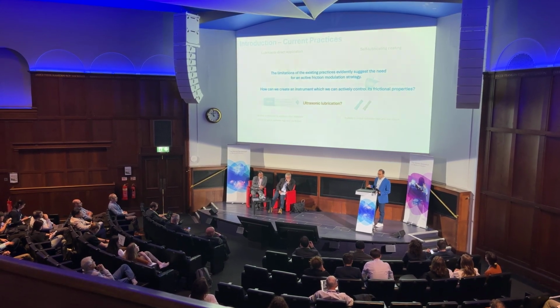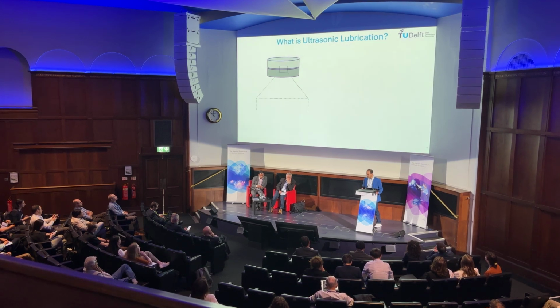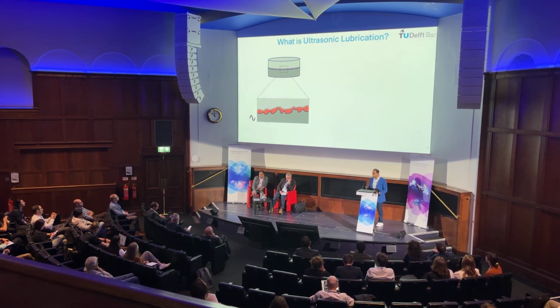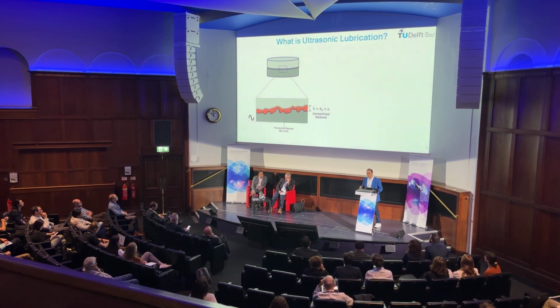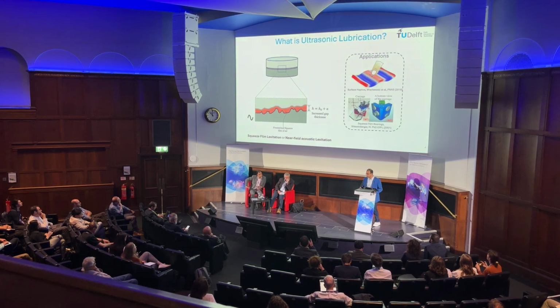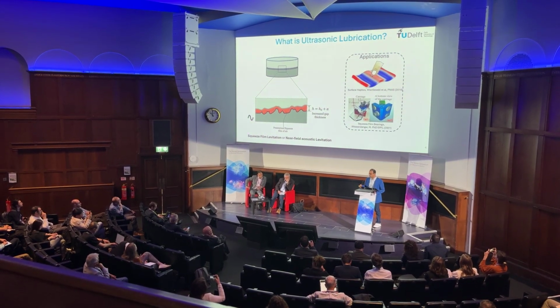One technology that can potentially answer this question is ultrasonic lubrication. But let's take a step back. What is actually ultrasonic lubrication? When you have two objects in close contact with each other and we start vibrating one of them at ultrasonic frequency in the transverse direction, it was found that a pressurized squeeze film of fluid from the surrounding medium is created, which separates the two surfaces slightly away from each other, resulting in reduced friction when they start sliding with respect to each other. This phenomenon is called squeeze film levitation, and it has been exploited in different applications, including surface haptics, touch screens, and squeeze film bearings.